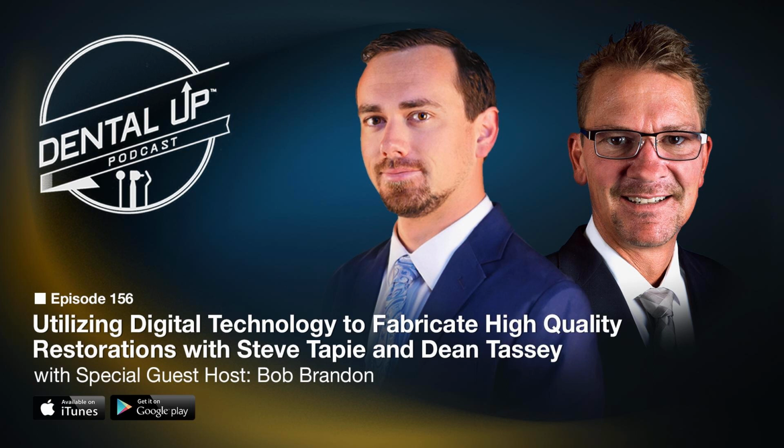Right. So you mentioned strength. What about bridges? What types of bridges are we able to produce in this material? With the aesthetic material, we're pretty limited, actually. We can only do 3-unit bridges with a single pontic, and we cannot have a pontic that's longer than 10 millimeters. Yeah. So that essentially rules out molar pontics. Yeah. We generally follow the guidelines for Emax type restorations, and we're talking premolar size pontics. If we have 2 pontics in a row, we're generally talking a lower anterior bridge, 23 through 26 with 2 pontics. Right. Even though we're in California, we still like to be conservative, and we don't want things breaking any more than you guys do. So we want to make sure we fabricate a restoration that's going to last a very long time.